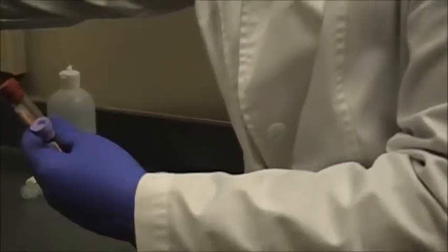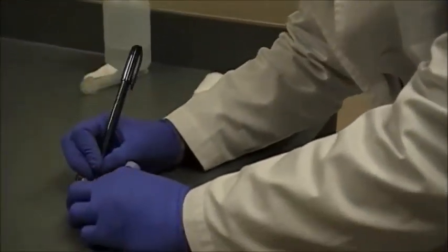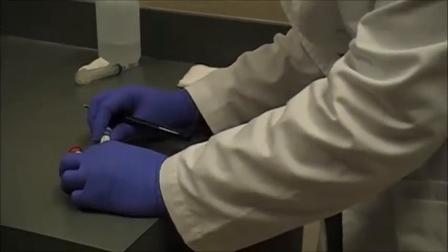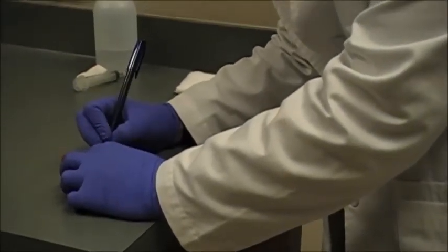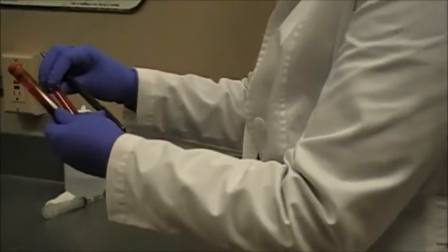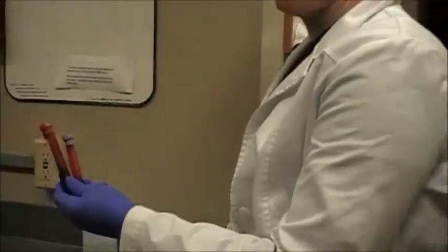So now I've got my red top and purple top. I'll label these with the patient's name. Then I'm going to let these clot for a few minutes before I centrifuge them to get the serum and plasma. I'm just going to set these on the counter and they can clot for about 20 minutes.